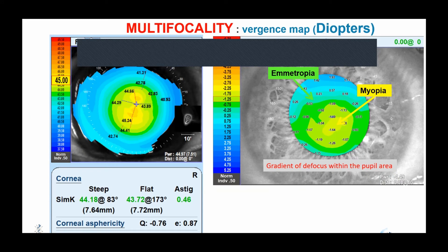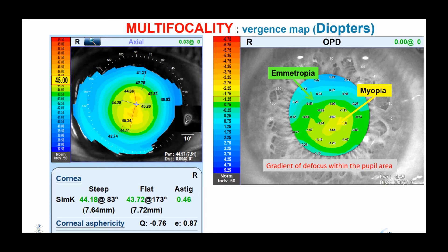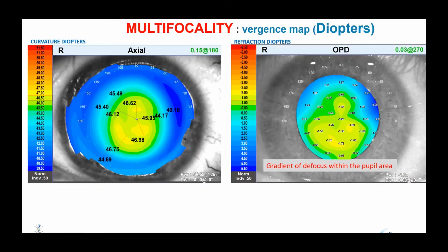Here is an example of successful multifocality, because unlike the previous example, the refraction is frankly myopic in the central region of the pupil. The hyperprolate asphericity generates negative spherical aberration, which gradually reduces the importance of this central myopization towards the edge of the entrance pupil. Here is another example of effective multifocality for the non-dominant eye — visible not on the corneal topography but on the vergence map, which reveals a zone of central myopization sufficient to induce good unaided near visual acuity, whereas this myopia decreases rapidly towards the periphery to improve uncorrected distance visual acuity.